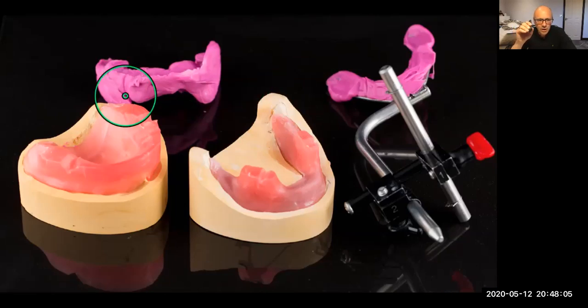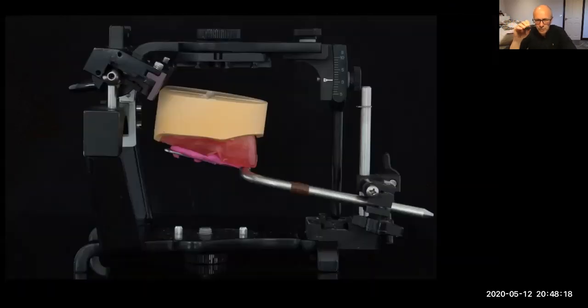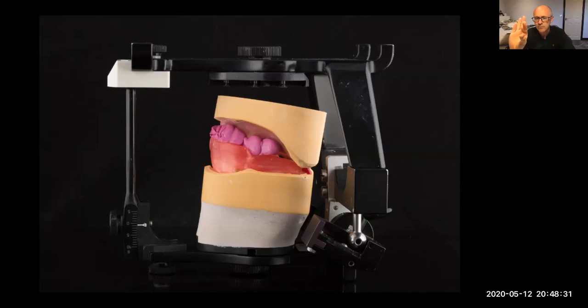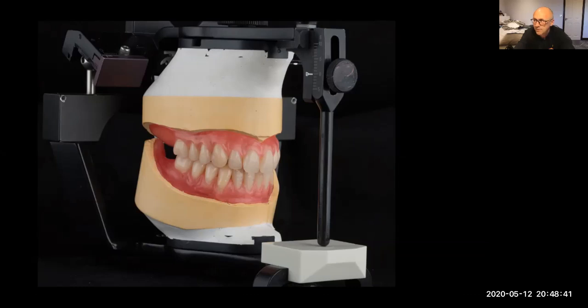So this is our upper trimmed rim, the lower pivot, the Futar D intermaxillary record, and the face bow here ready to mount it on the articulator. Dead easy. And so Rowan mounts the upper definitive model with the face bow here, so the plaster's fitted, and then the articulator's turned upside down, and then our Manchester rim is fitted there, and then we've got the patient all ready to go.